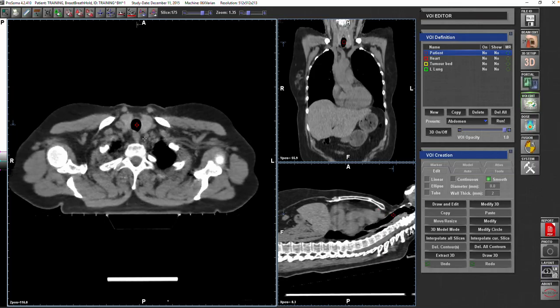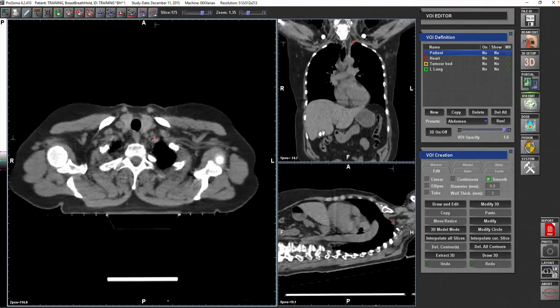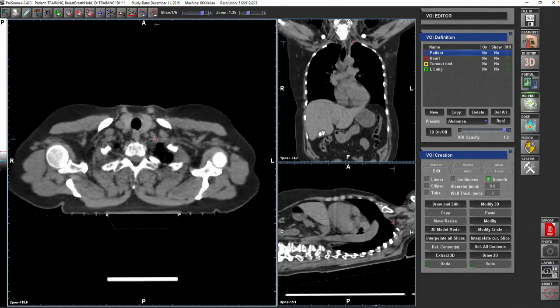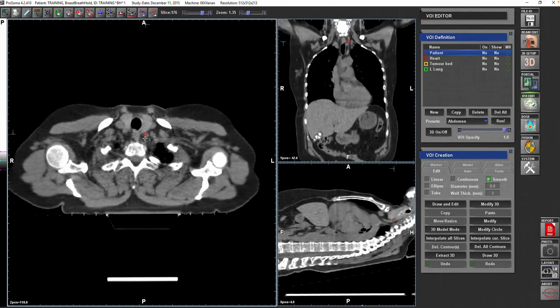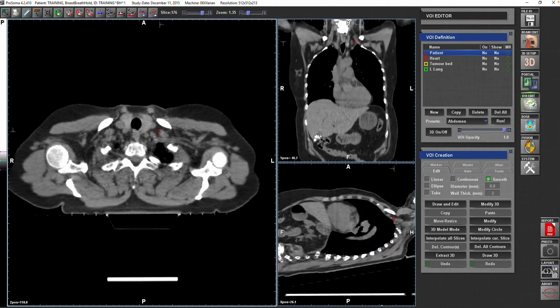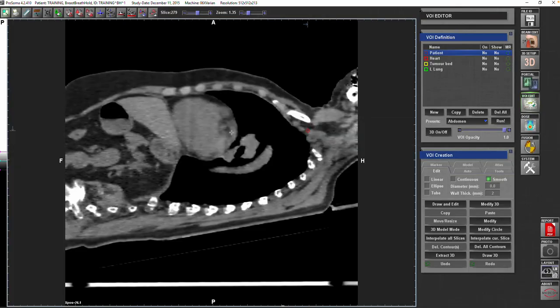You read in the text that the subclavian artery is cranial and posterior to the vein, or in other words, the vein will be caudal and ventral to the artery. And sometimes I get confused, how can the artery be cranial and at the same time ventral.